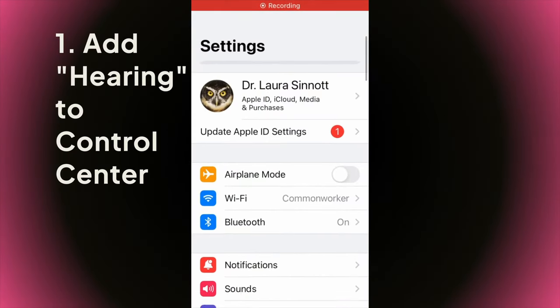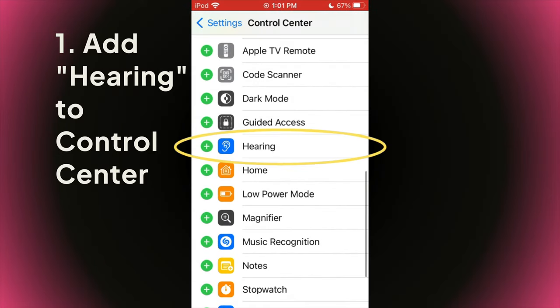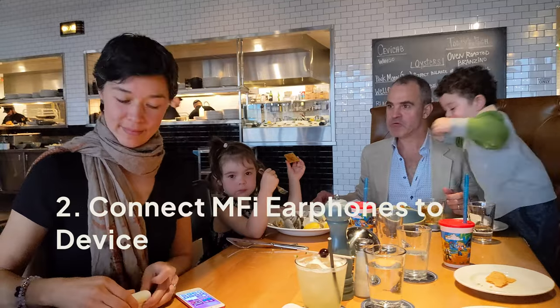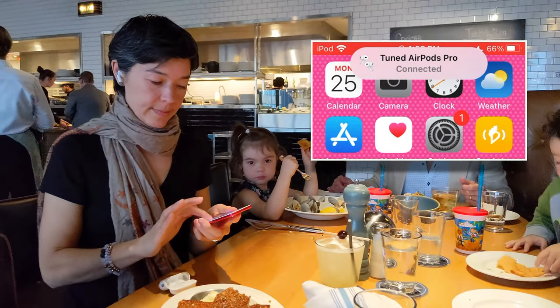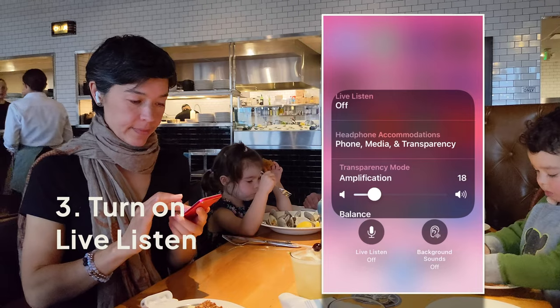First, set up a hearing shortcut on your control center. Next, connect your AirPods or any MFI-enabled earphone to your device. Then, open the hearing shortcut and tap on Live Listen to enable it. You'll see the audio meter move when you talk.